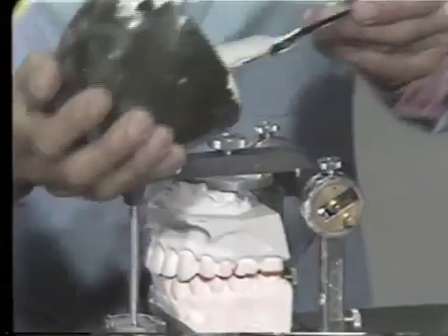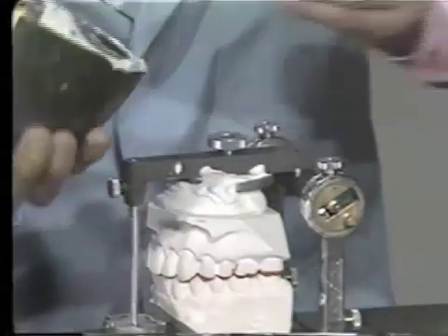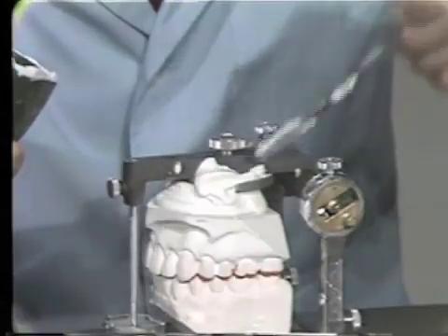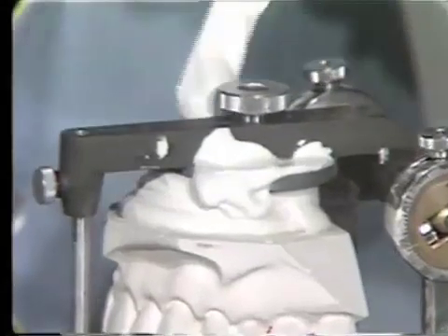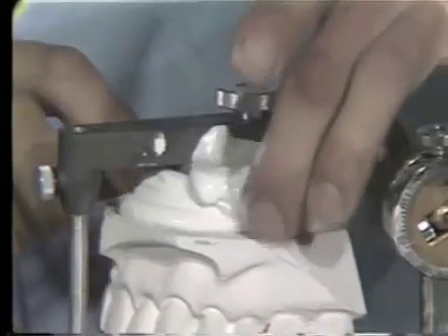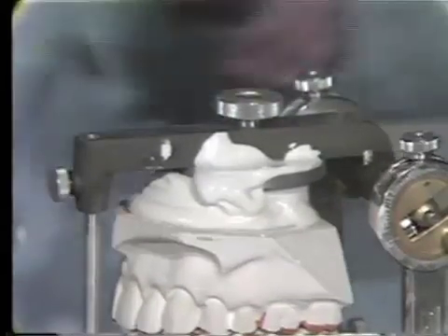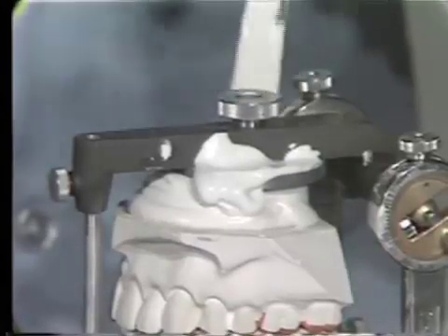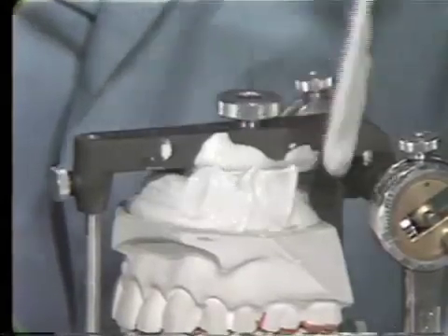Again, this upper one — this is the initial luting of the stone cast. Remember that you have to put the wax between the thumb screw up here and the plaster. Always checking to make sure that your casts are in exactly the same place and that they're not rocking. You might even put pencil lines that you used to cue it up.